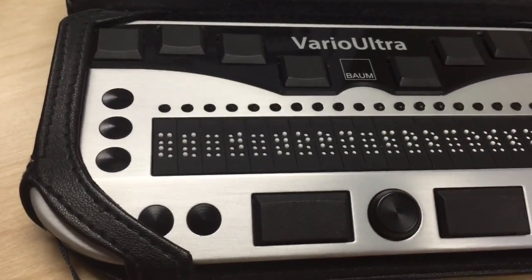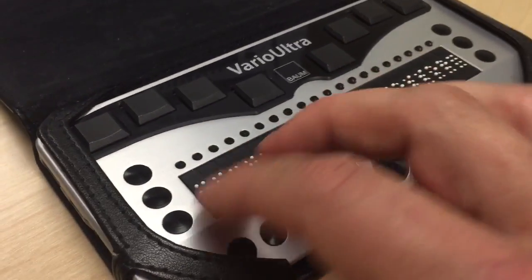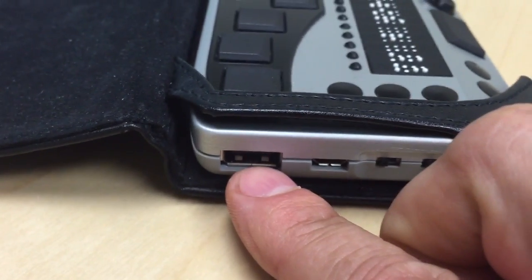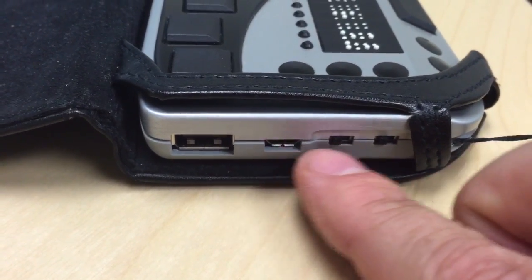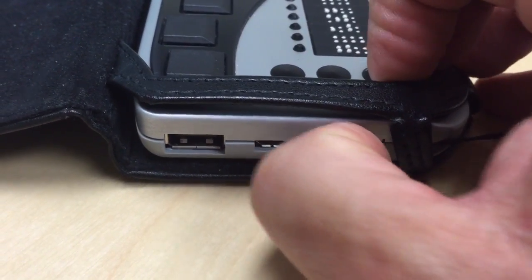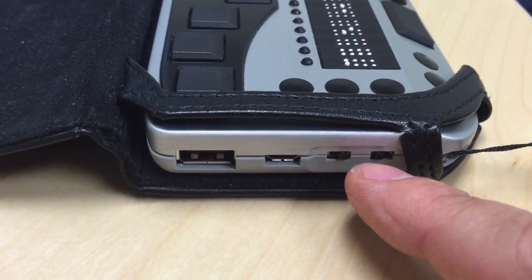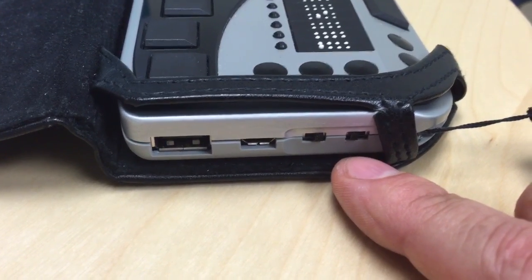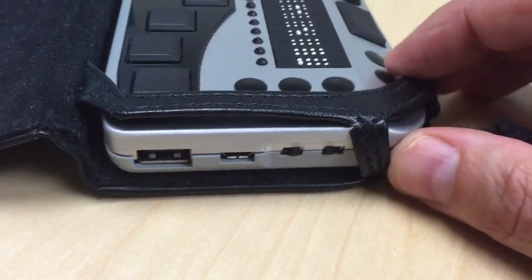So that's something you can do very easily. We're in braille note taker mode, which means you can use Vario Ultra happily without being connected to anything. If you want to connect to a device, on the left-hand side we have a standard USB port at the very back, then a micro USB which we use for power and also for connecting to devices via USB. There's the device mode switch — right now it's facing toward the back of the device. There's also the device lock switch, so when you're powering it off and putting it in a bag, you can put it in a lock position to prevent it from accidentally being switched on.